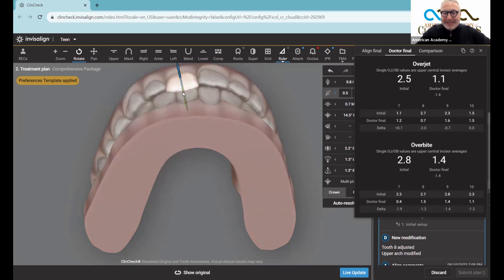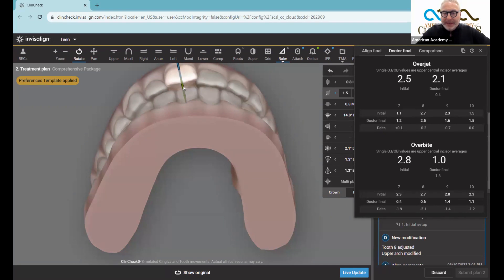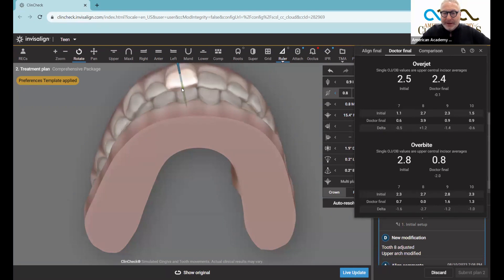So as I move this tooth in and out, you'll see the doctor final overjet for tooth number eight increasing all the way to 3.9 and then decreasing.